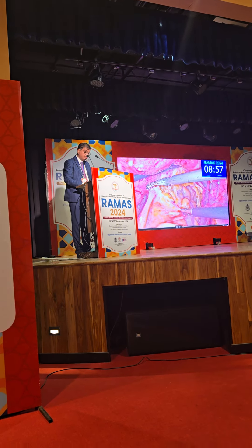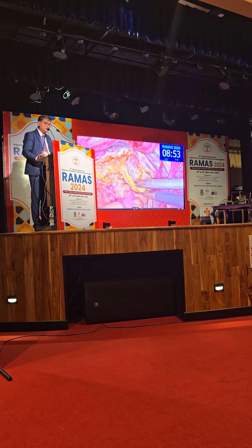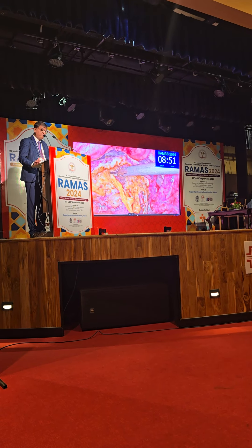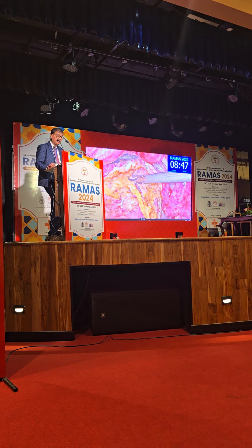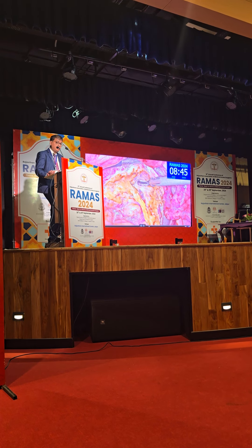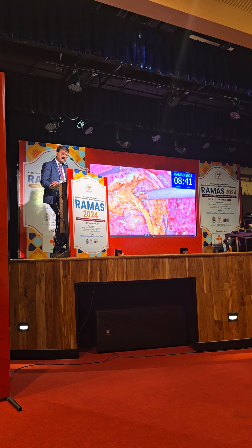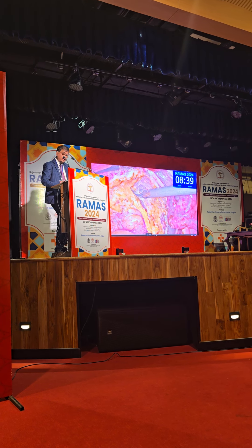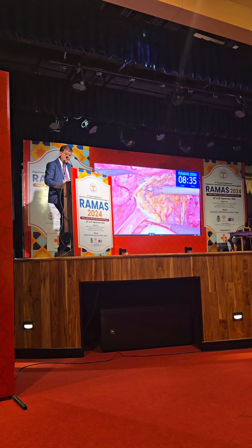You can see the complete division of the area — these are the two layers of the Denonvilliers fascia. You have to go and mobilize the rectum as much as possible. This is a completely edited film, but you see not a drop of blood because you are in the right plane. It's all about understanding and going into the correct planes. This is the pouch of Douglas that you will mobilize.